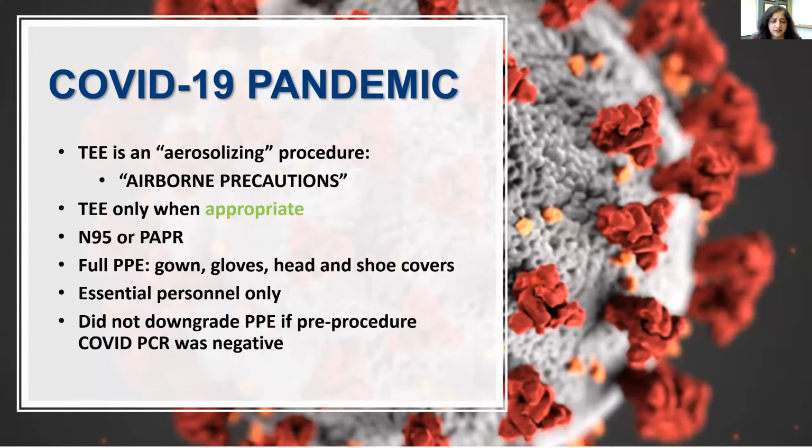A few last words on the COVID-19 pandemic. I know we've all lived through it. TE is an aerosolizing procedure, as we all found out, and for TE, airborne precautions were what was recommended by the CDC. We did TE when it was appropriate, and we tried to avoid it when it was inappropriate. We performed TE with full PPE, including N95. Other institutions had used PAPR, and we tried to limit it as much as we could to essential personnel only.